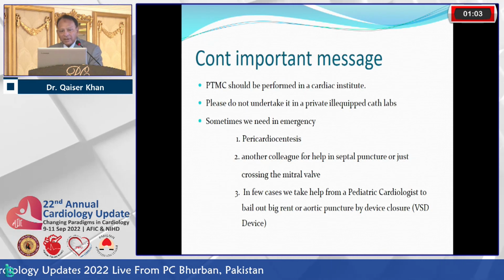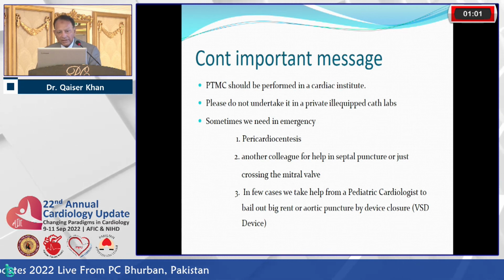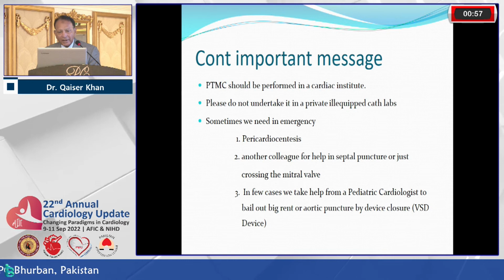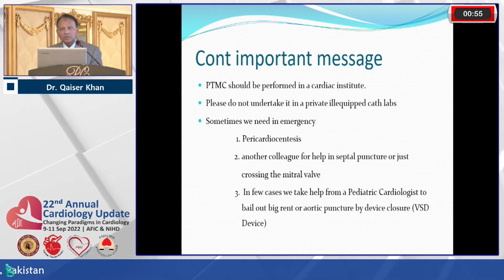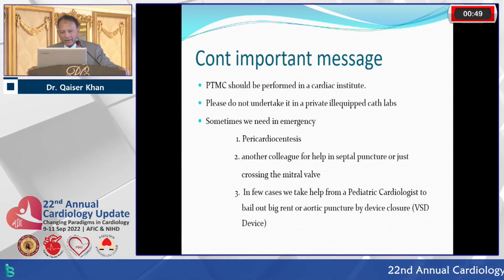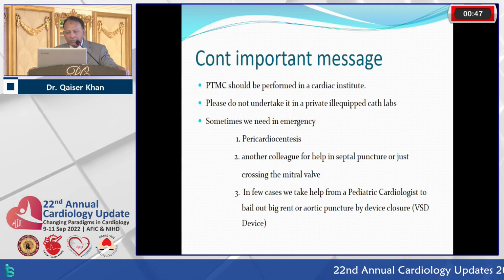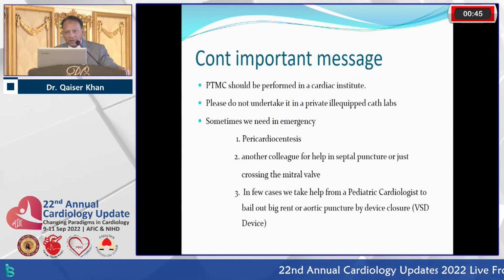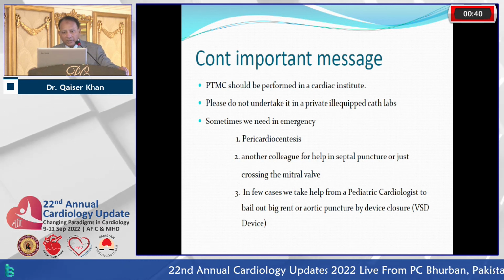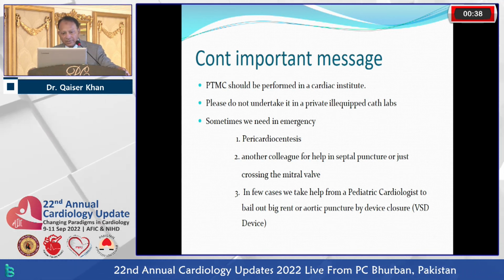So an important message I want to tell our colleagues, especially the junior colleagues, is that PTMC should be performed in a cardiac institute, not like these days our junior colleagues are performing the procedure in ill-equipped private labs. So why? PTMC should be done only in a cardiac institute.